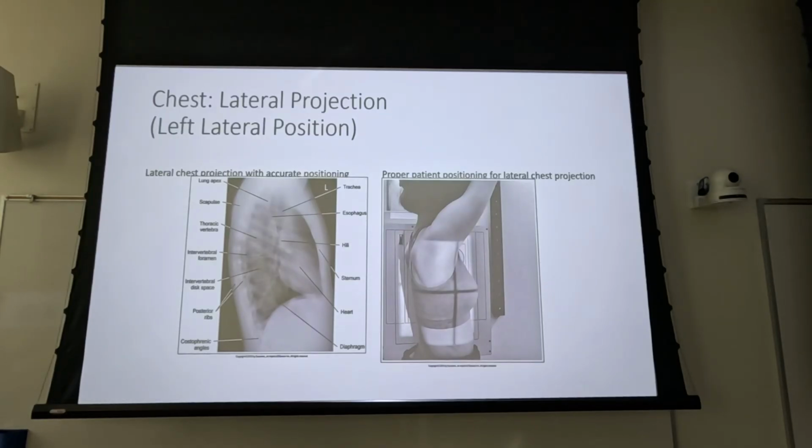Real gut check here: how hard is it to get a perfect lateral chest X-ray? It's almost like getting a perfect lateral knee, right? It's just not as easy as it seems like it should be, because of the number of them that we shoot. The patient's going to be rotated just a little bit. Could that not be partially due to the divergence, because the right ribs are so much further than the left ribs? Potentially, yeah. I hadn't really considered it, but potentially.